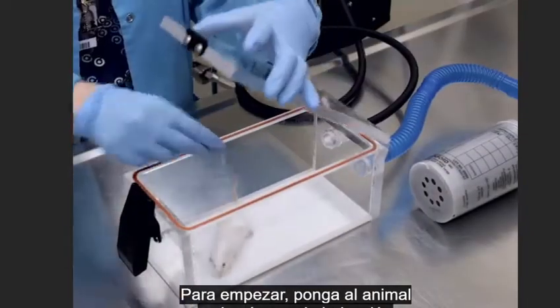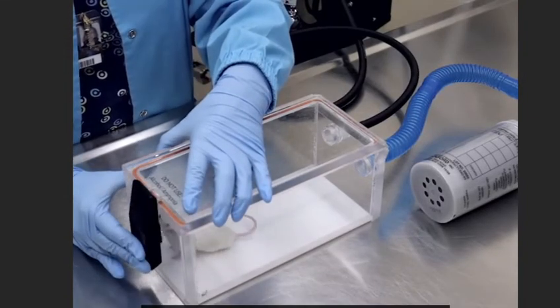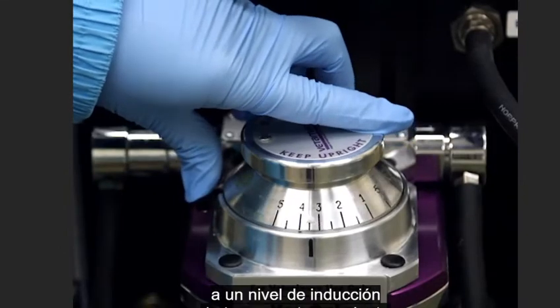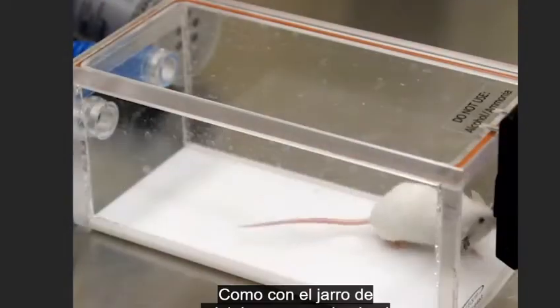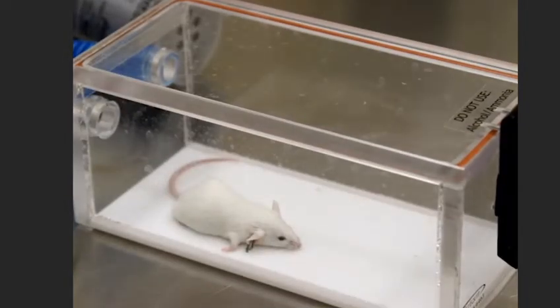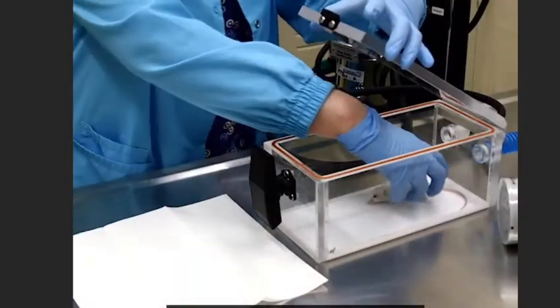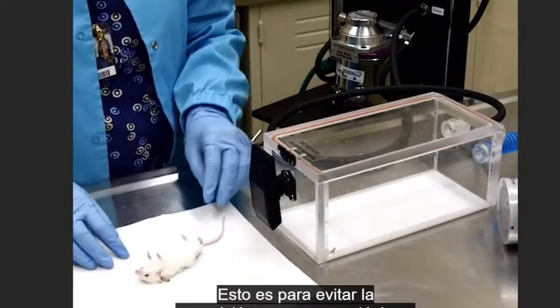To start, place the animal into the induction chamber and secure the lid. Once the animal is in the chamber, first start the oxygen flow at a rate of 1 liter per minute, then adjust the precision vaporizer setting to an induction level of 3–4% for isoflurane. Expose the animal to the anesthetic to effect. Once the animal is fully anesthetized, flush the chamber with oxygen by turning the isoflurane off before gently removing the animal. This is to prevent personnel exposure to anesthetic gases.